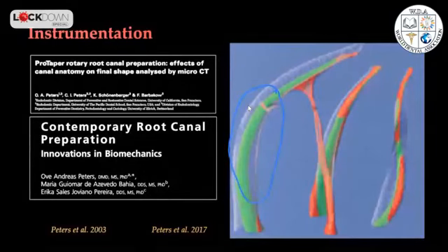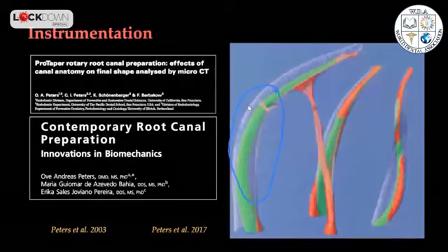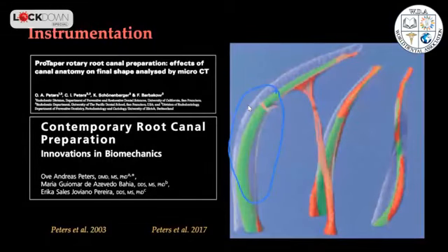Now, in 2020, this is common knowledge. We understand that our instruments do not contact all the parts of the root canal wall. So, what happens to these walls that are not touched?